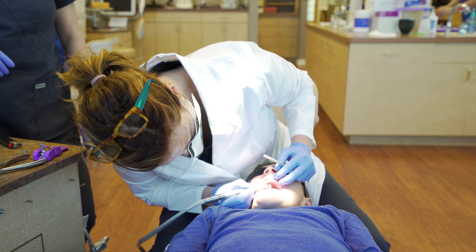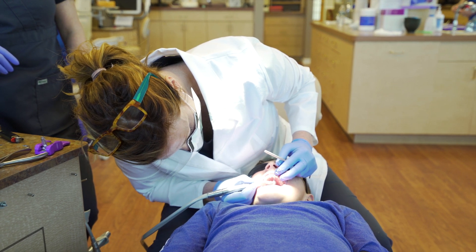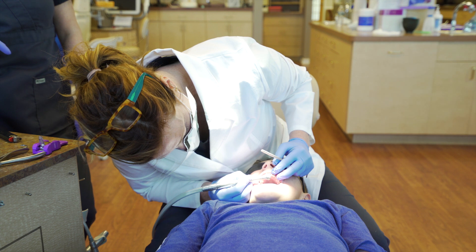Here we are sculpting the bite blocks to feel even and to the proper height so the back teeth are just slightly separated.